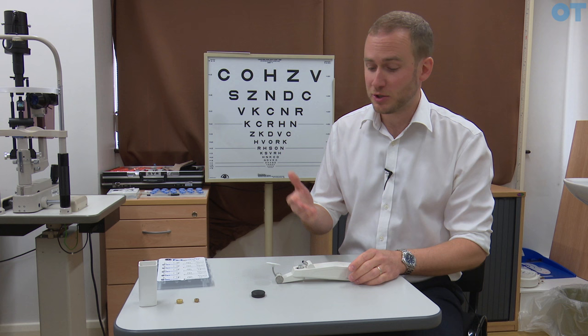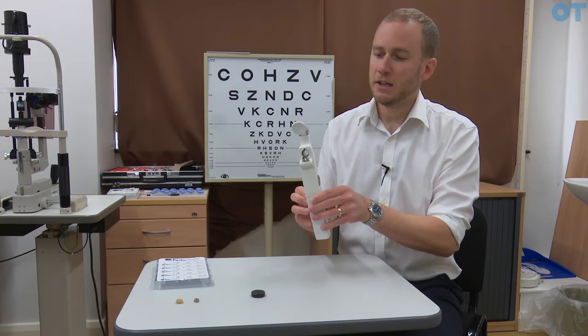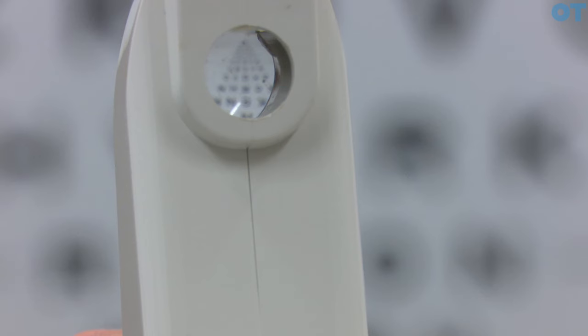One method that we can use to measure intraocular pressure is a Perkins tonometer. At the bottom we have a battery pack which takes four AA batteries that attaches to the bottom of the instrument. At the top of the instrument we have a brow bar which can be extended and retracted using this knurled knob here.